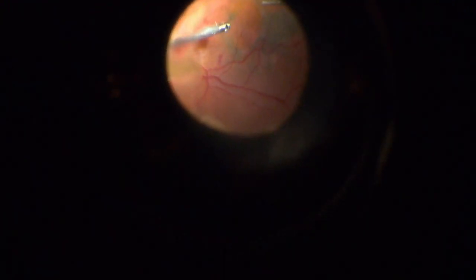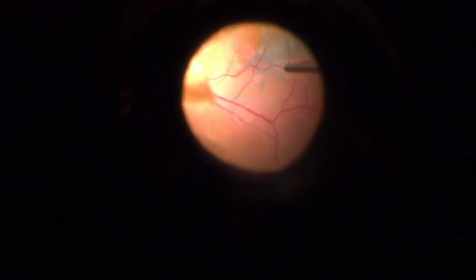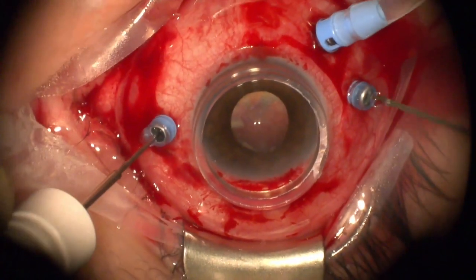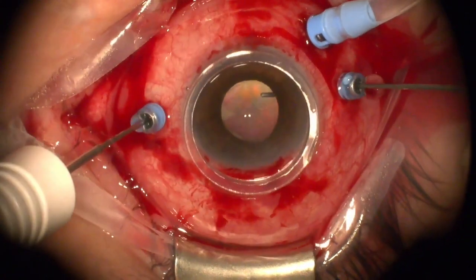So it took off that big piece. Here's the ILM behind it. Oh, I'm not as comfortable with that. I'm going to come back to the forcep, and feel a little bit more with this. You're doing well. The scar tissue's coming off real nice.